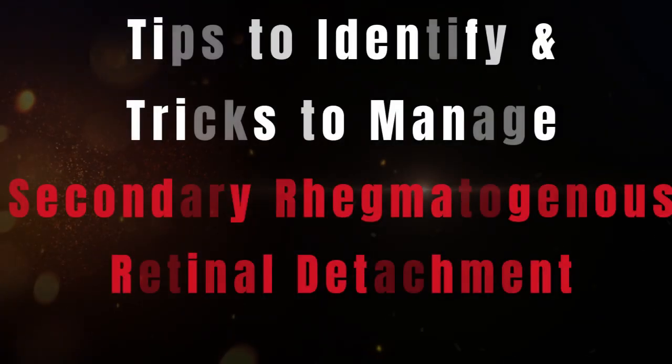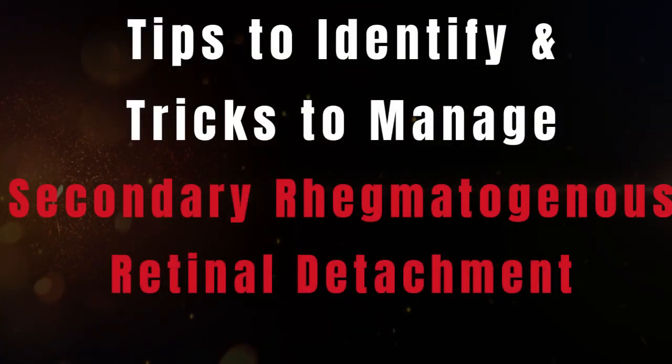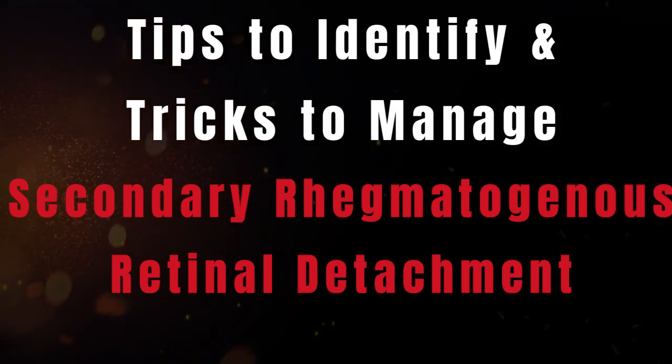The following video will describe tips to identify secondary rhegmatogenous retinal detachment and its subsequent surgical management.